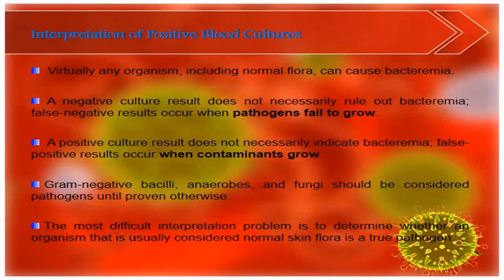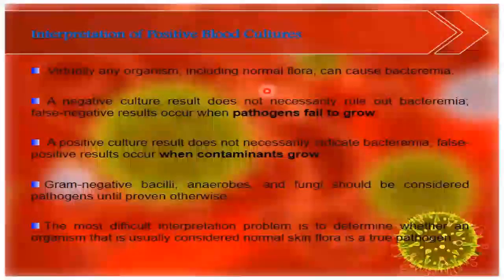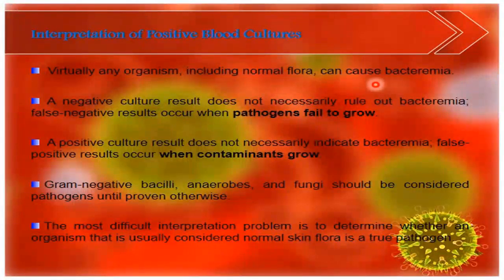The interpretation of positive blood culture. Virtually any organisms, including normal flora, can cause bacteremia. A negative culture result does not necessarily rule out bacteremia.